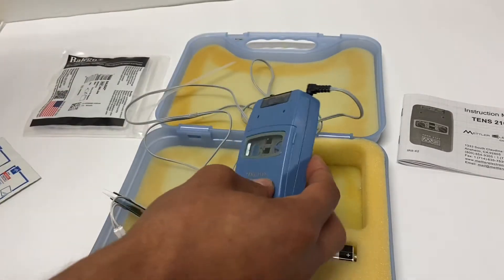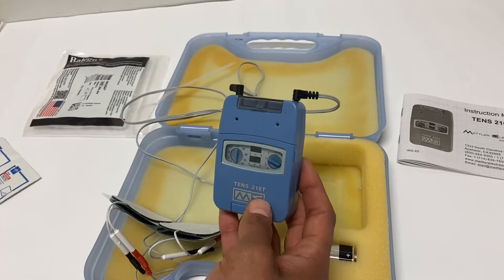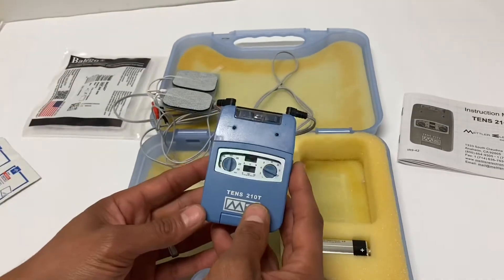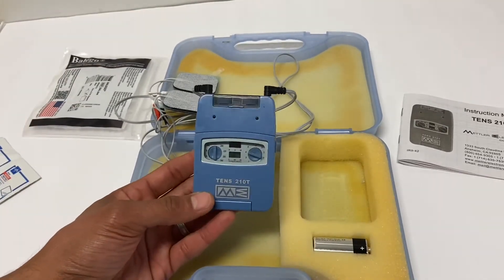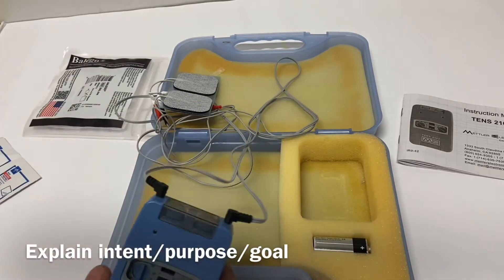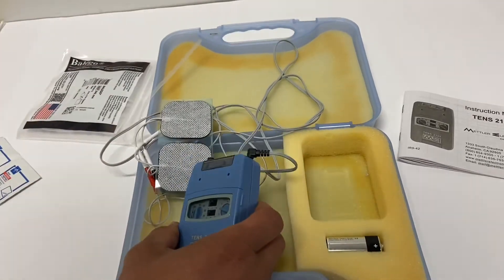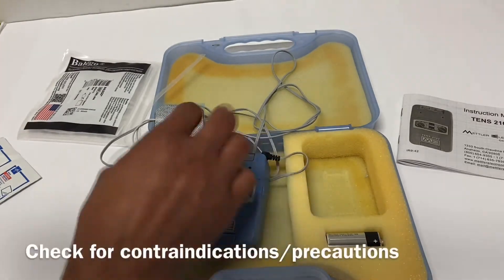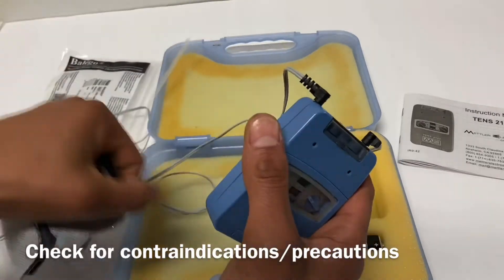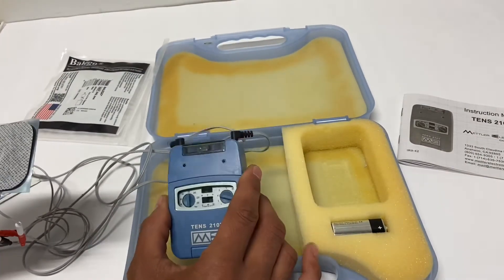When we're going to apply any kind of electrotherapy, we want to think of our standard I-DEBT concept. We want to start by explaining the intent or goal and what to expect with the electrotherapy — for example, using this to reduce pain, manage inflammation, whatever the intent is. We want to check for contraindications and precautions for why we wouldn't do this on the patient. I'm not going to list the all-inclusive list — it's in your notes — but I suggest getting a nice consistent spiel so you don't miss any.